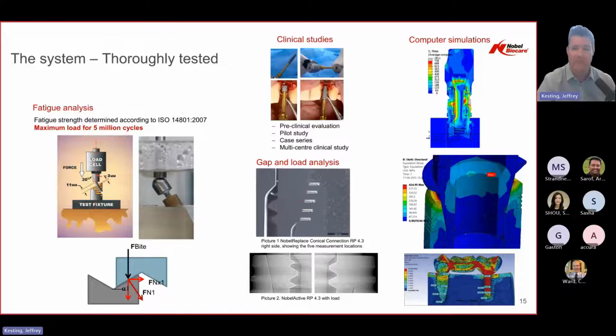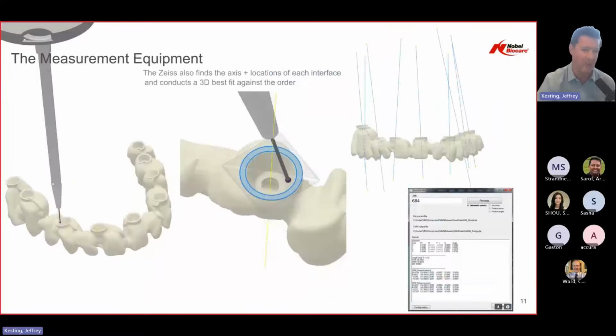And that can be anything from fatigue analysis to gap and load analysis, clinical studies, many clinical studies in the industry, and also computer simulations, so we can see how these products react and how they work before we even get them onto the market. So we thoroughly test everything we do to assure that quality.